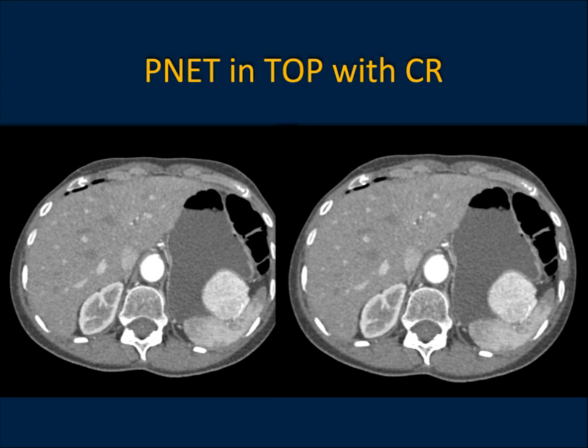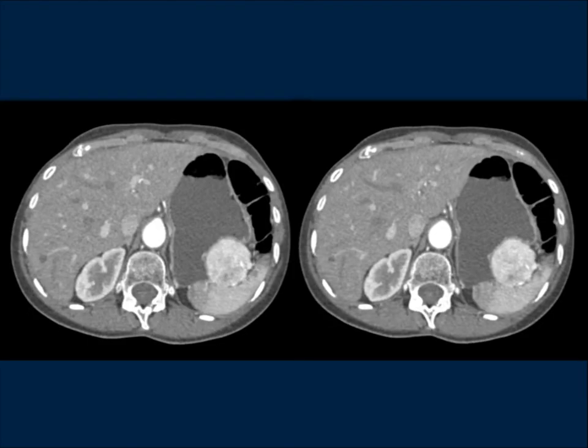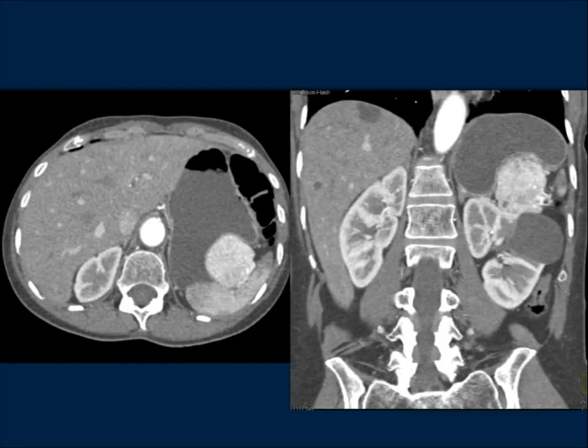Here's a good example: this is by the splenic hilum, and you want to say accessory spleen. But the point is, it's much brighter than the spleen on arterial phase — much brighter than the moiré pattern. There's no chance this is an accessory spleen. This is a neuroendocrine tumor off the tail of the pancreas. Sometimes people mistake a neuroendocrine tumor and call it an accessory spleen, so you can make this error in either direction.